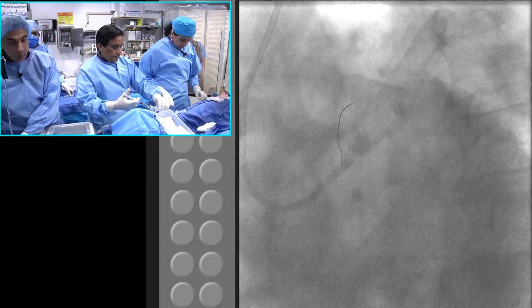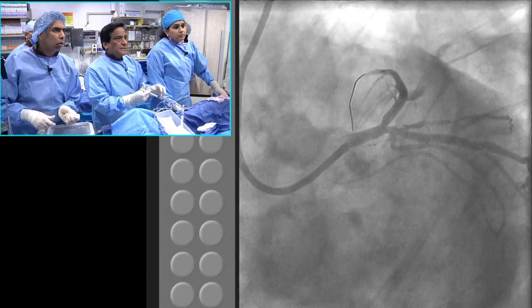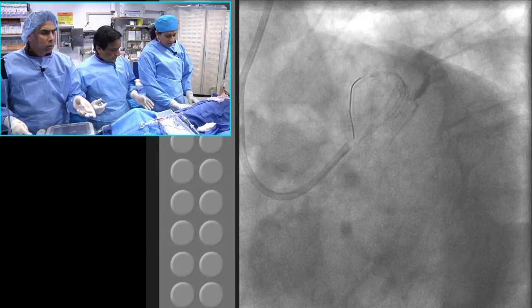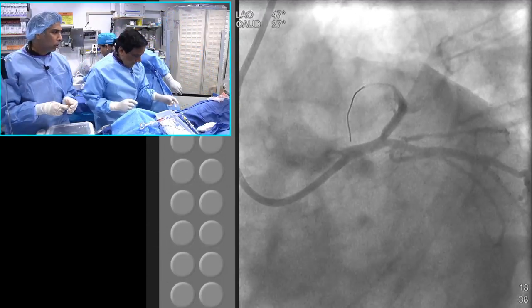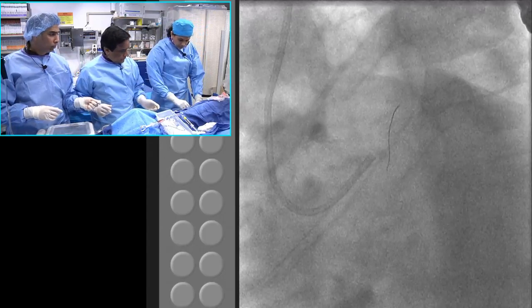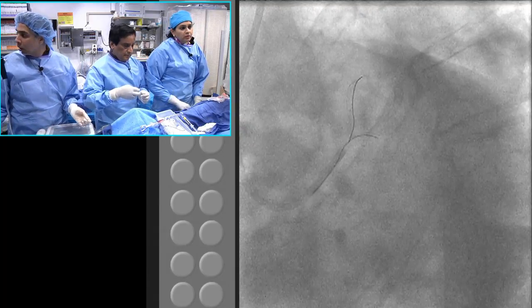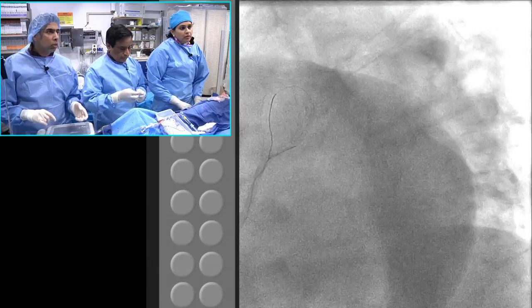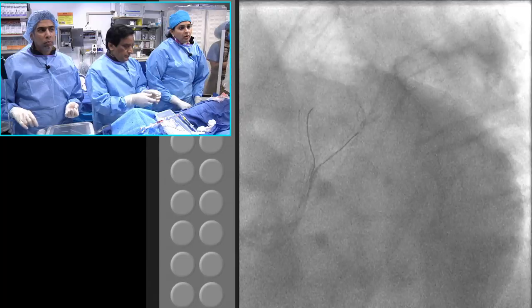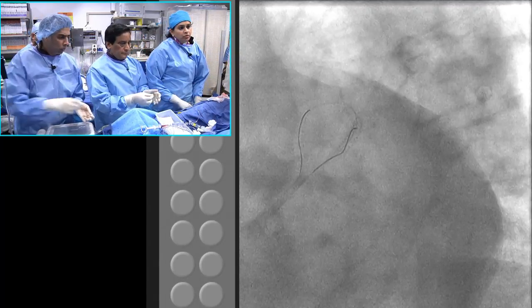Okay, ready? Go. Now there's some ST elevation still. Any medicine? Because of the diagonal. It could be that we had the wire not for the one. Okay, let's cross it with a Twin Pass or something like that. Give him some medicine. Between the possibilities of dissection and thrombus, it's probably more thrombus, you think? Let's get a bolus of integrilin also, please. Not a new wire. Let's see if this goes.